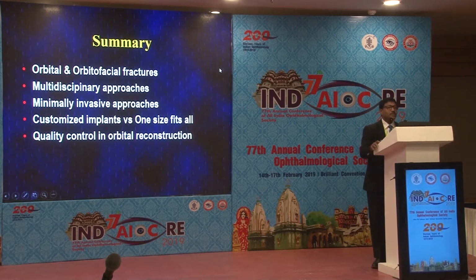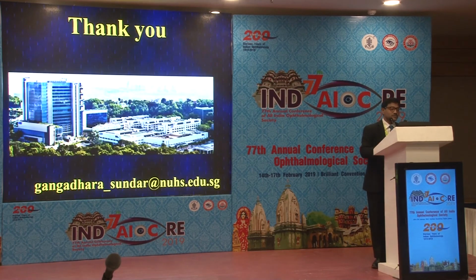So in summary, orbital and orbitofacial fractures lend themselves to a lot of new advances and concepts. Principles are the same, but there are new technologies as well. Learn the concept of multidisciplinary work and multidisciplinary approaches. Adopt minimally invasive approaches like our chairperson really talked about. We are moving away from standard sheet implants to customized patient-specific implants. One size doesn't fit all. And finally, make sure you're the kind of surgeon who ensures there's good quality control.